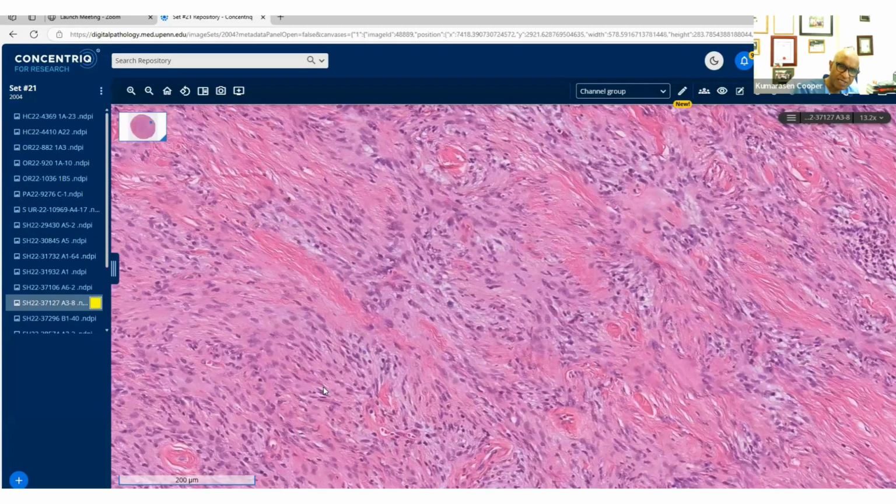So the idea is when you see spindle cells in soft tissue, if it's benign, then is it fibroblastic? Is it myofibroblastic? Is it nerve sheath? When you're thinking nerve sheath, if there's myxoid areas, yes, you have to consider low-grade fibromyxoid sarcoma and then do the MUC4. If it's in an appropriate location and has sweeping fascicles, then I do the beta-catenin for fibromatosis.